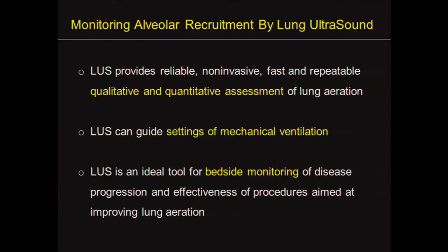So I go to my conclusion. Lung ultrasound, in my opinion, provides reliable, non-invasive, fast and repeatable, both qualitative and quantitative assessment of lung aeration, can in some way guide settings of mechanical ventilation, and is for sure an ideal tool for monitoring, because it's repeatable and you don't need to move the patient.